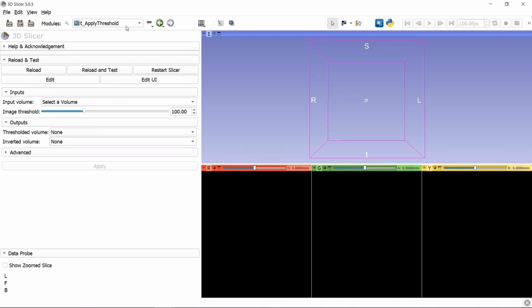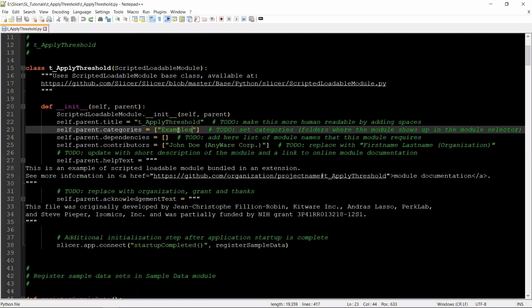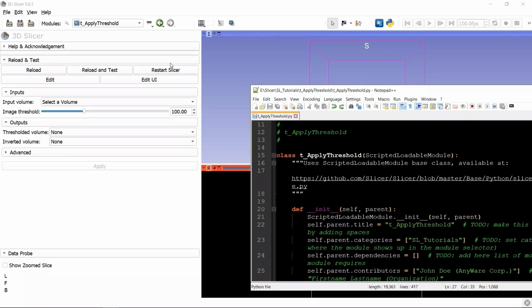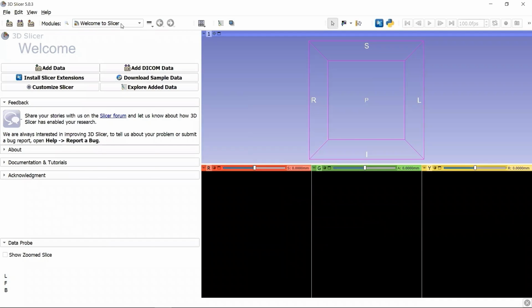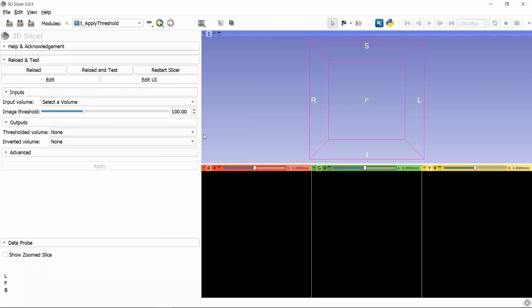In order to fix the small bug and replace the category from Examples to Tutorials, we need to edit the Python file. Click the button Edit, and the Python file will be opened by the default application. What we need to do is to change the category from Examples to Tutorials. After saving the Python file, we need to restart Slicer. Click the button Restart. Here we go. When we go to the module selection, the category Examples is gone, and our category Tutorials is on the top. That's great. We fixed the bug.